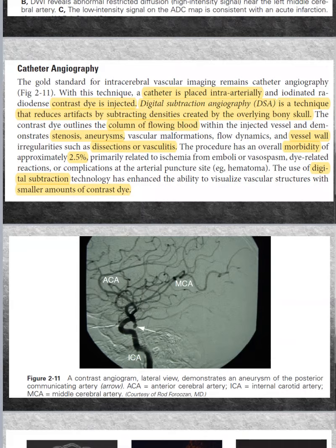A catheter is placed intra-arterially, and iodinated radio-dense contrast dye is injected. I may have digital subtraction. This digital subtraction is important in decreasing the noise. Okay, and this noise may be a result of the overlying bony skull. Okay.